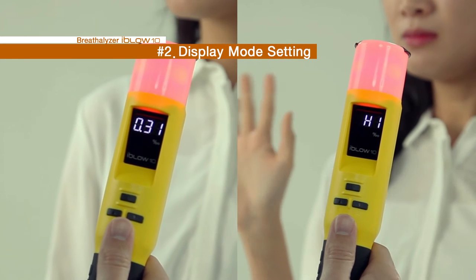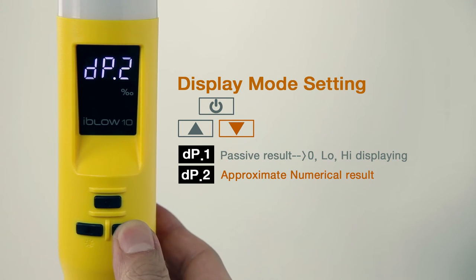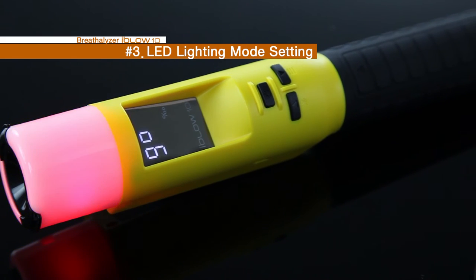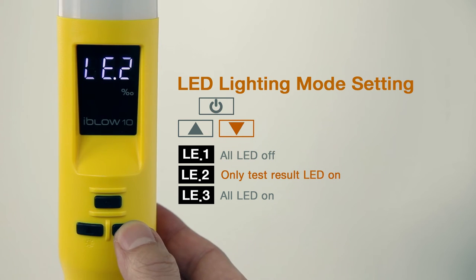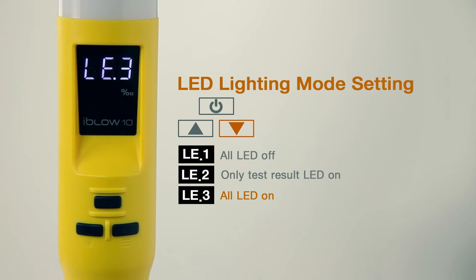2DP is a test result display mode, where DP1 indicates three levels — zero, low, high — while DP2 indicates the approximate value and numbers. 3LE is the LED display mode. In LE1, all LED functions are turned off. LE2 shows only the test results. LE3 can be used in both standby to blow mode and to display test results, while the light is always on.